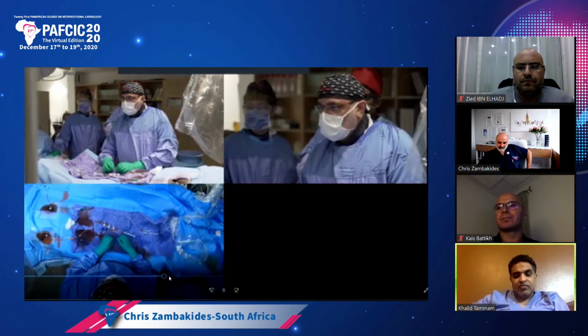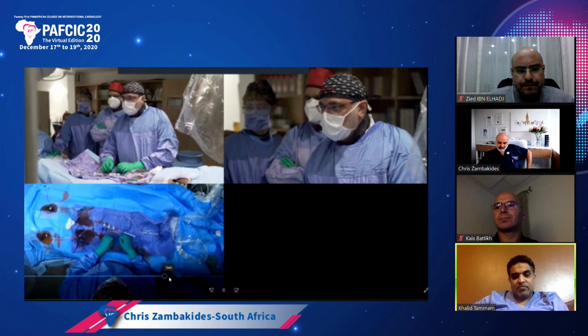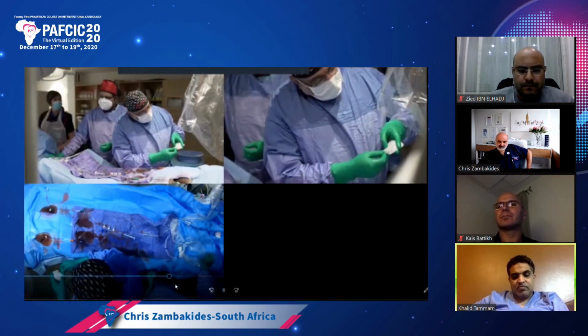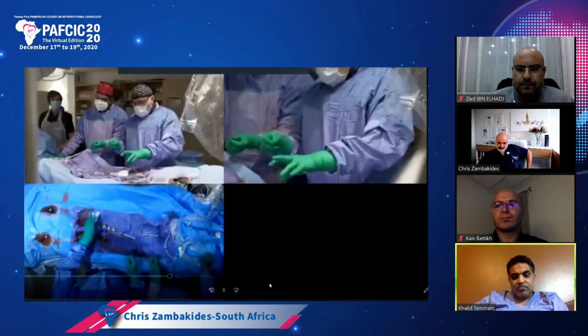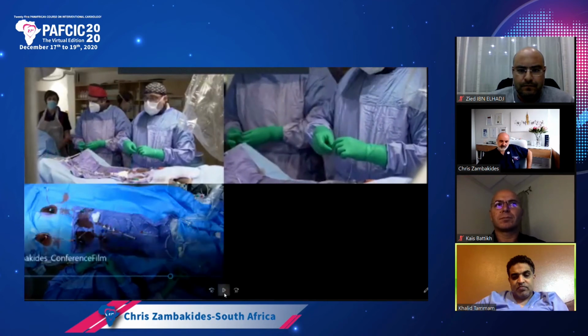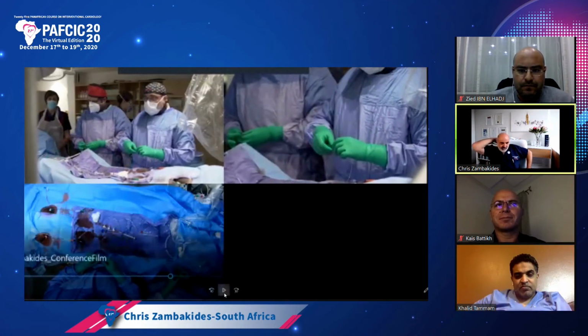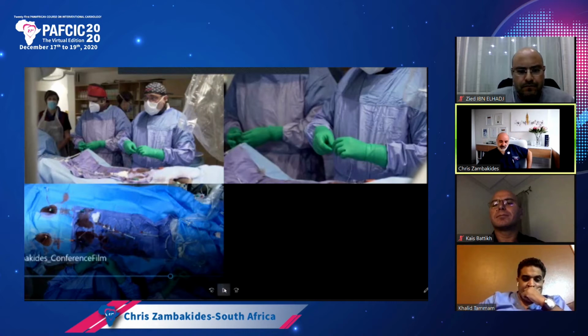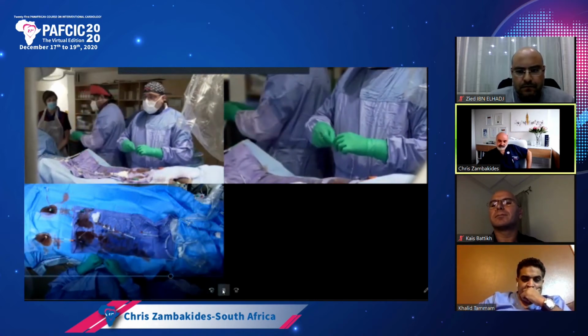So we need to get something to redirect into the stent. You'll see that it's already got a little pre-shaped curve of about 1 or 2 millimeters, and it's got a 1-to-1 torque. So we'll be able to direct it, get into the stent. So with the Gladius, we kept going around the stent. So what I've done now is I'm taking a Gaia Second, which is more directional and it's got more strength, to try and see if we can then go through the cap and into the stent. Then go back to the Gladius to knuckle up.